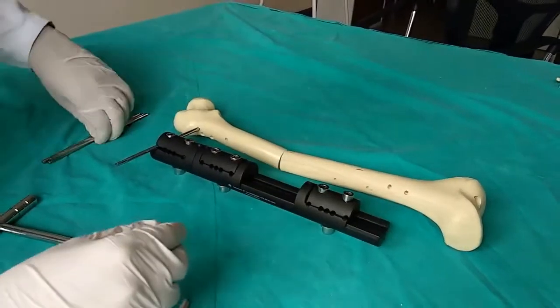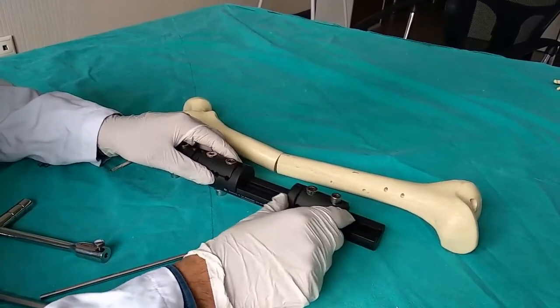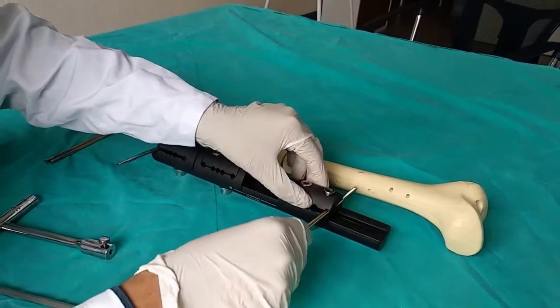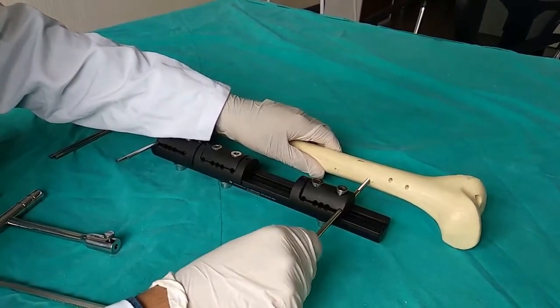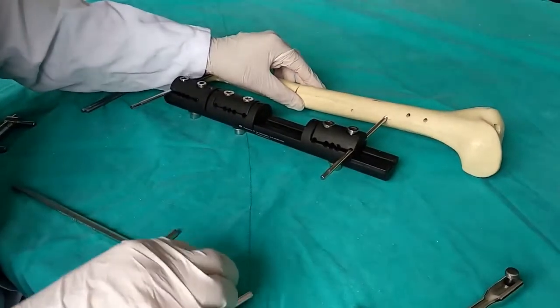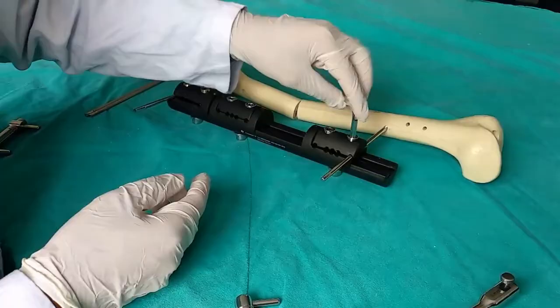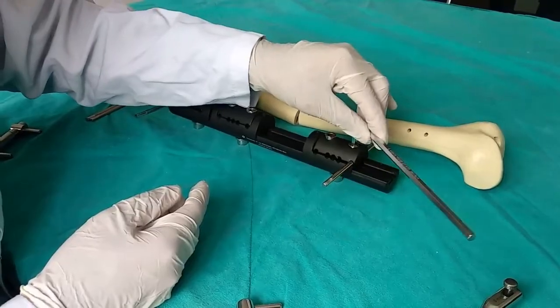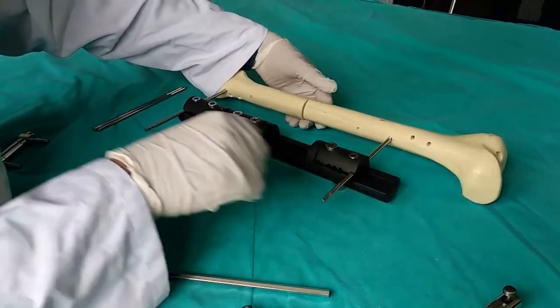We make sure there is no empty space between the shanz screw and the clamp, but we don't fully tighten it. Then we go to the other side. The surgeon arranges the exact position of the second shanz screw, and since we are doing the lengthening, we make sure that some distance is left. We place the second shanz screw at the surgeon's decided position.